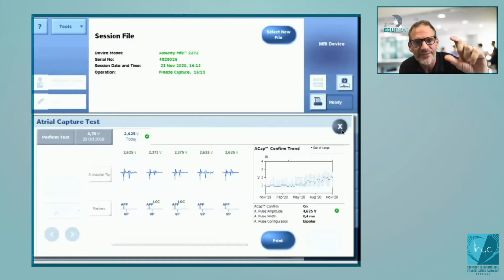It will progressively decrease the amplitude, but the APP will not be consecutive. That's why sometimes some tracings are a bit strange. If you record something at the time of the atrial threshold, you will be surprised to see AS, and sometimes APP, AS, APP, not consecutive APP.